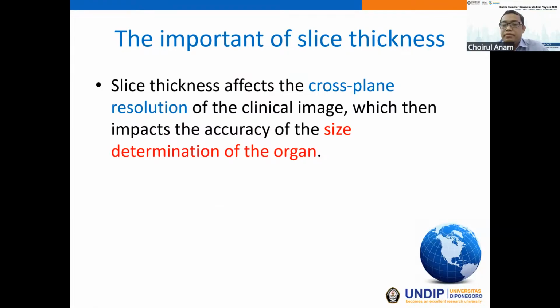As I mentioned before, the slice thickness affects the spatial resolution in the cross-plane image, and it impacts the accuracy of determination of the size of the organ. In radiotherapy, it is very important to use a very thin slice thickness because the definition of the organ will be more accurate.